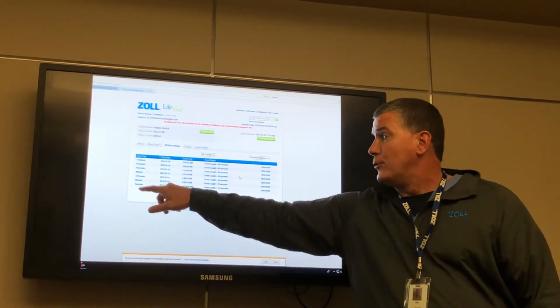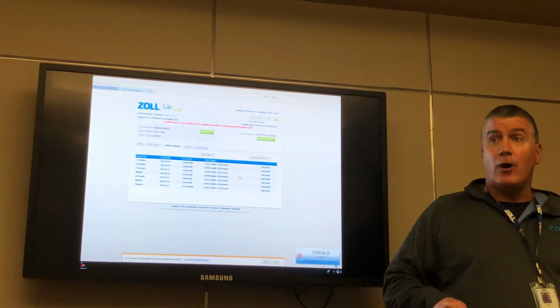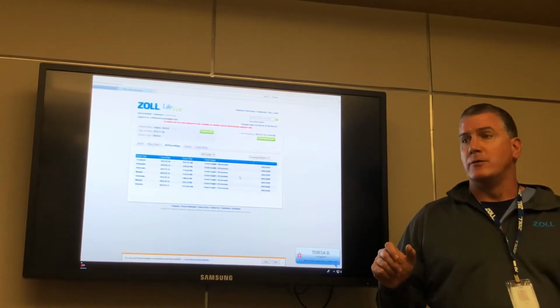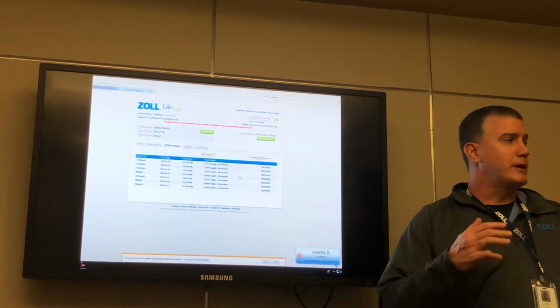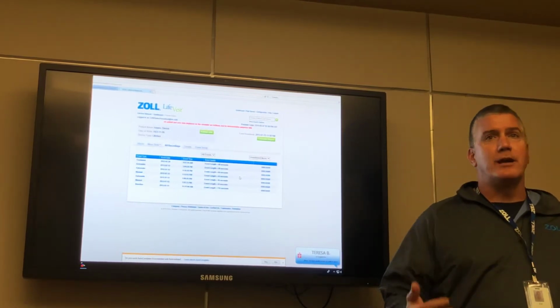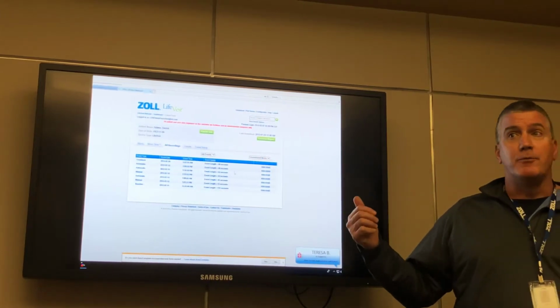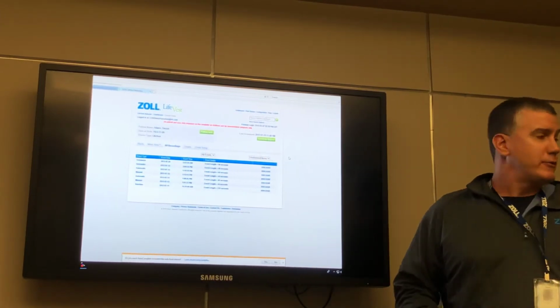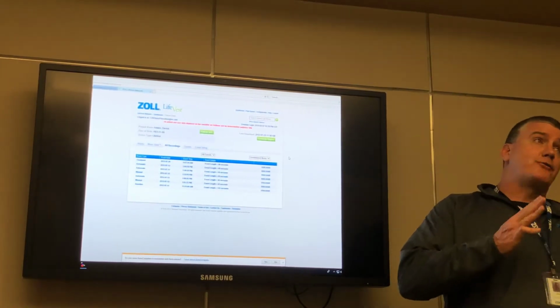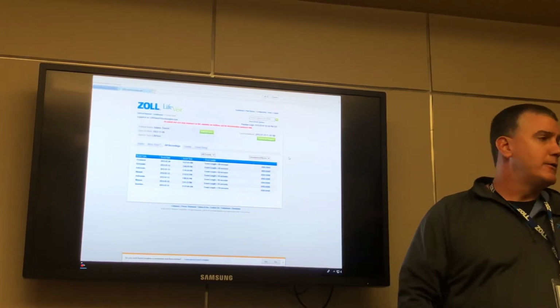Other things, a manual report. That means they push the buttons on the device. There's 2 buttons, they have to squeeze them together. They hold those buttons for 3 seconds. It'll record, just like a loop monitor will record. So we tell the patients when they go home if they're having palpitations, feeling lightheaded, feeling like anything that's cardiac related, to push those buttons and record. So that if they come see their provider, they can have access to this and see it. How long? It usually backtracks 15 seconds, is it 30 seconds forward? 30 seconds. Yeah.